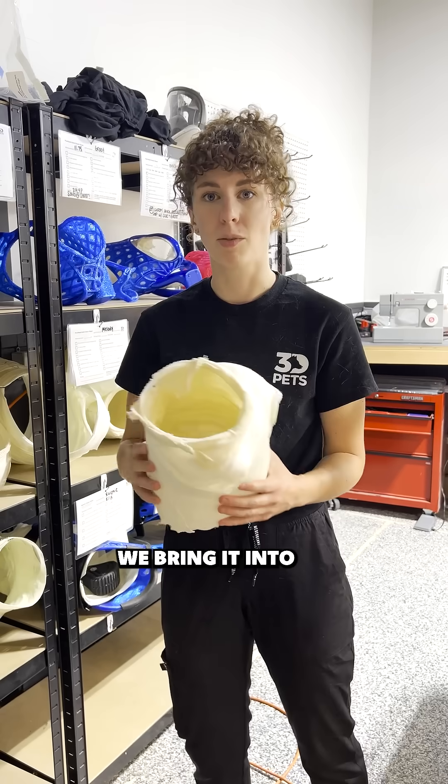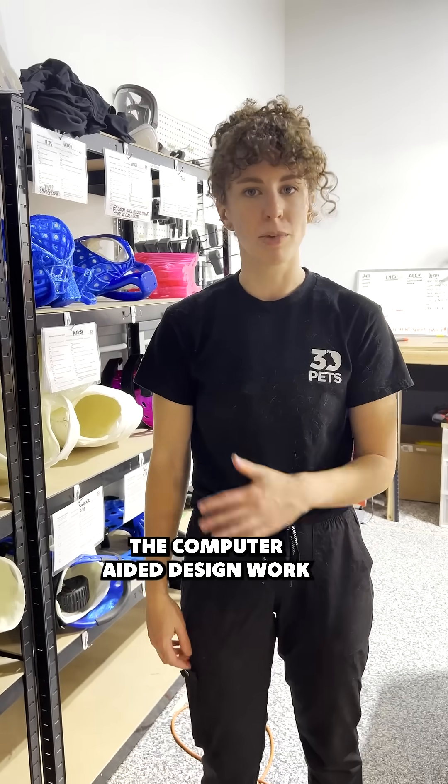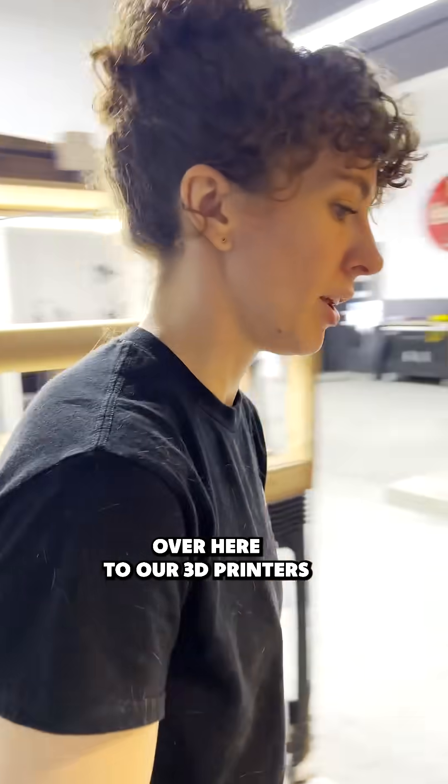Once we get the scan, we bring it into our custom computer algorithm. We do all of the CAD work — the computer-aided design work — and once we get that finished file, we send it over here to our 3D printers.